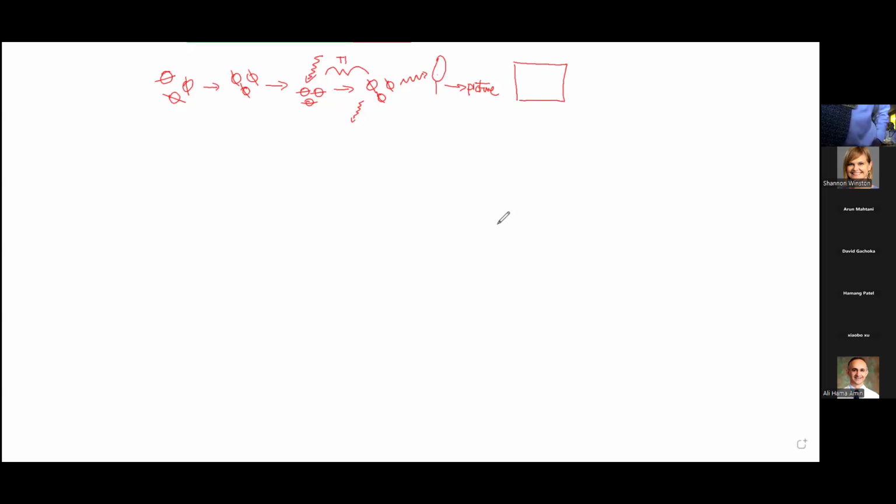And we talked also about signal. From the images, we talked about the pixel sizes, and up here the voxel sizes: voxel if it's 3-dimensional, pixel size if we talk about 2-dimensional.